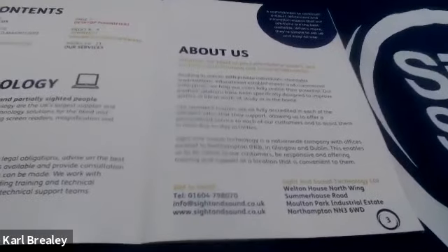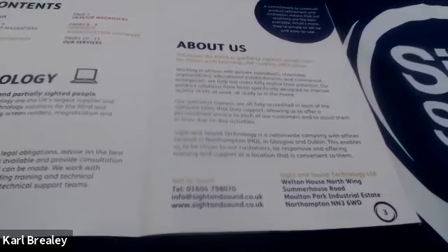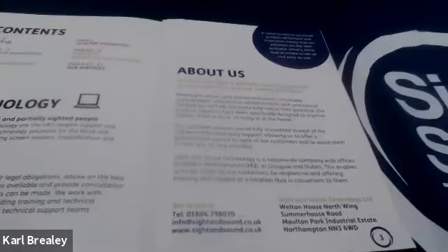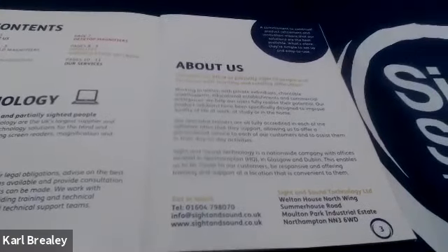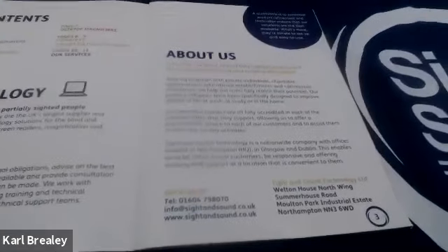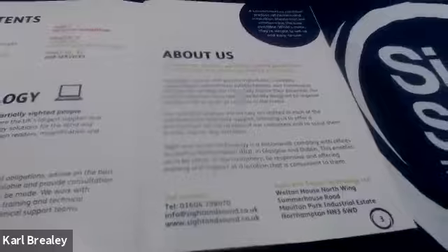Okay. I'm just going to run through these really quickly. Monique, yes, you can change the speed. I have it quite low because it's from when I last demoed it, and people do ask to turn the speed down. This will go from very slow to ridiculously fast. So yes, you can adjust it. That was my great demonstration of how to change the speed. Carl, we actually answered that one while you were out of the room, but you answered it far better than I did because you did the sound effects as well.